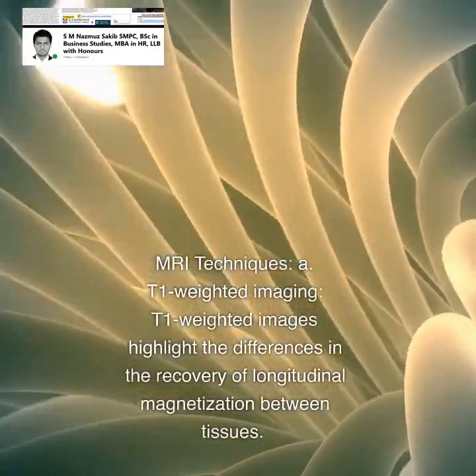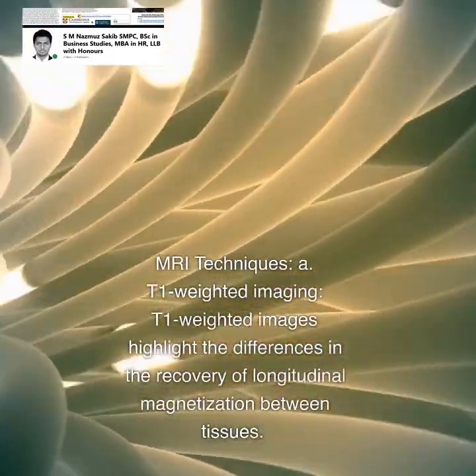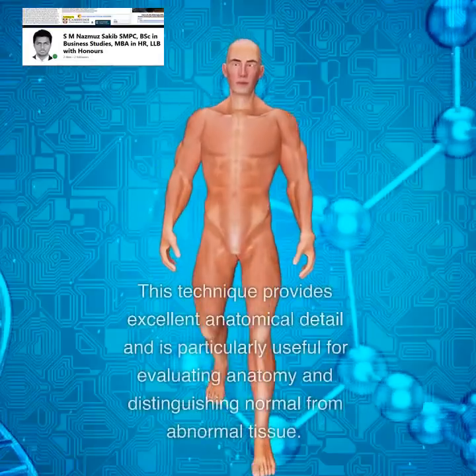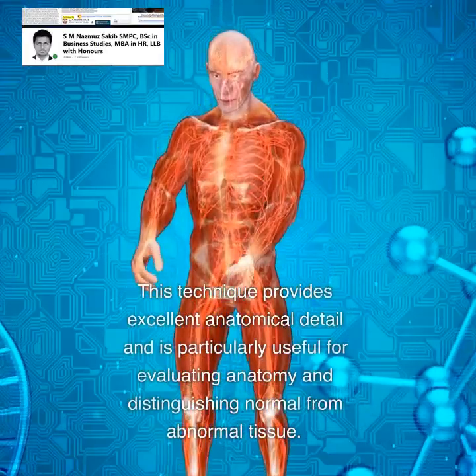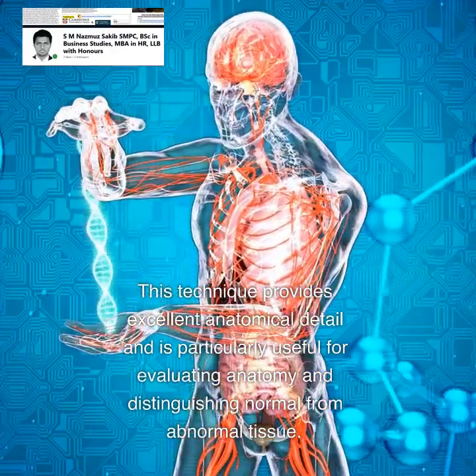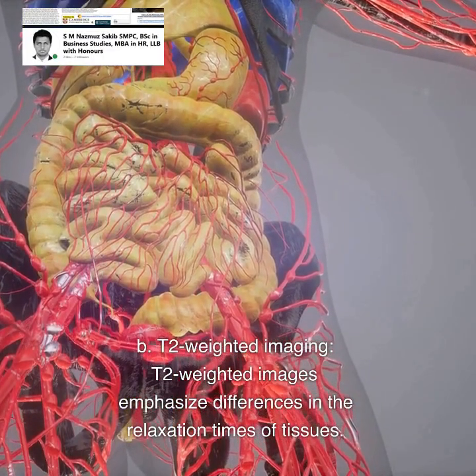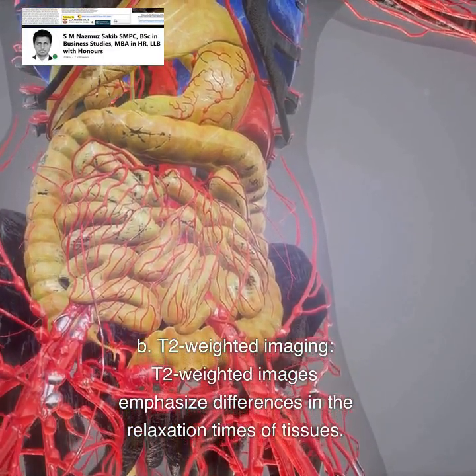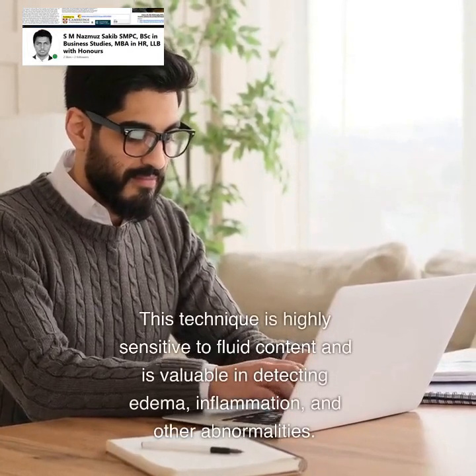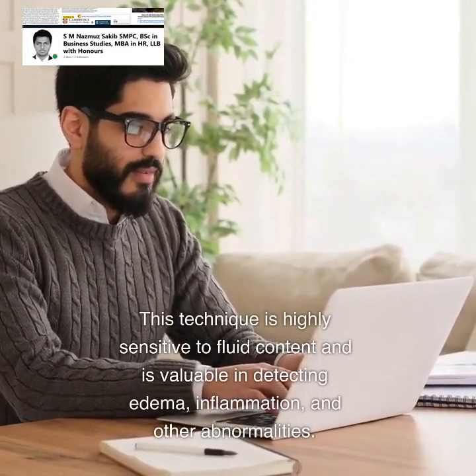MRI techniques. A. T1 weighted imaging. T1 weighted images highlight the differences in the recovery of longitudinal magnetization between tissues. This technique provides excellent anatomical detail and is particularly useful for evaluating anatomy and distinguishing normal from abnormal tissue. B. T2 weighted imaging. T2 weighted images emphasize differences in the relaxation times of tissues. This technique is highly sensitive to fluid content and is valuable in detecting edema, inflammation, and other abnormalities.